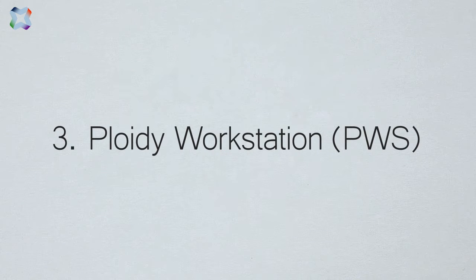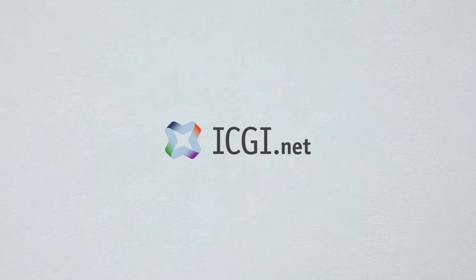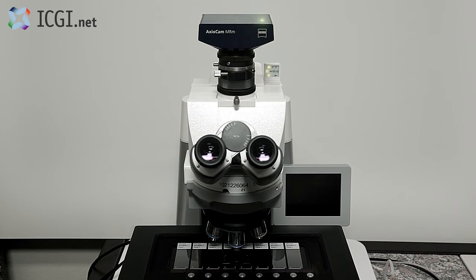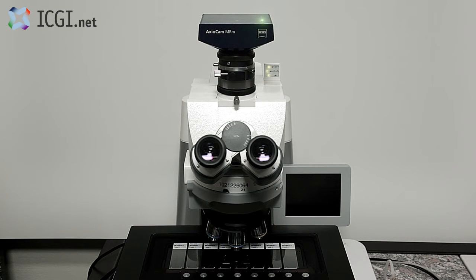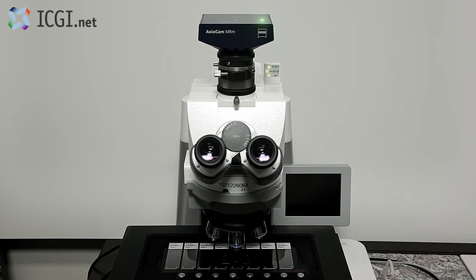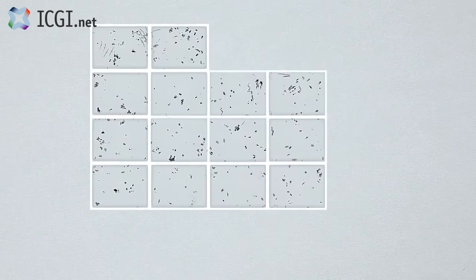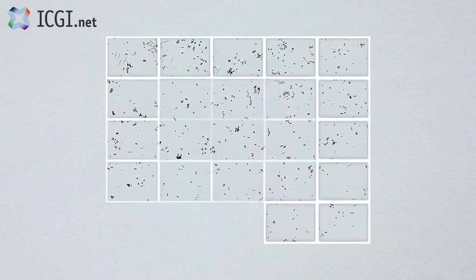The DNA content in the nuclei is measured with the Ploidy Workstation (PWS) DNA analysis software developed by ICGI. PWS consists of two applications, PWS Grabber and PWS Classifier. PWS Grabber steers a motorized microscope which is fitted with a high-resolution digital camera. This apparatus scans the slide by incrementally traversing the surface area of the sample until the whole monolayer has been digitally imaged. Up to 900 images are captured for each slide.